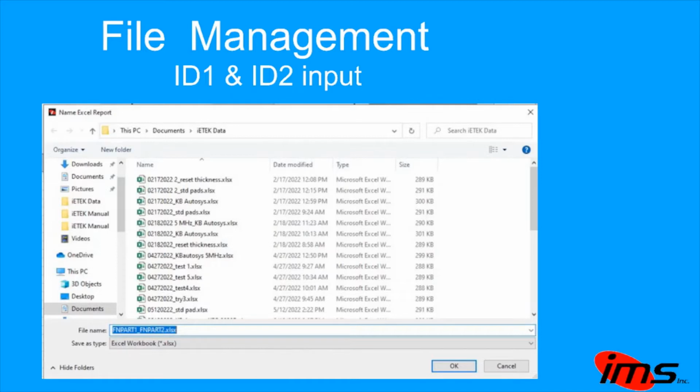The files are stored in the documents iETEK directory. And if you want to change the name, you can do that, and then you can hit OK, and the box will disappear. All of the report data will be stored in this file.